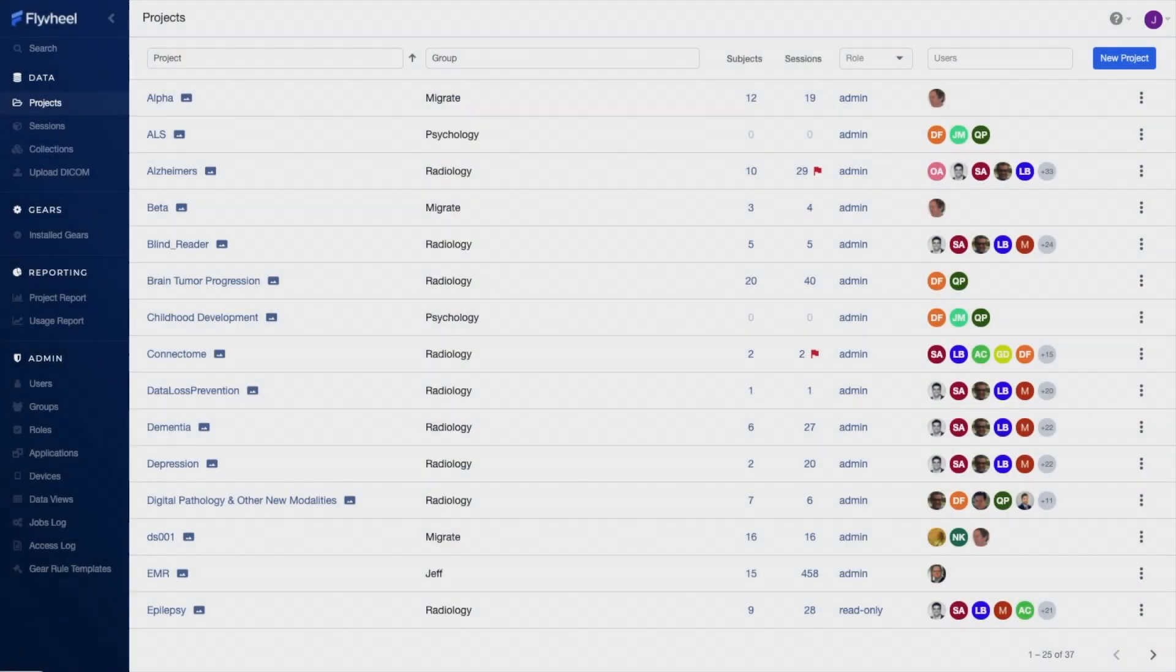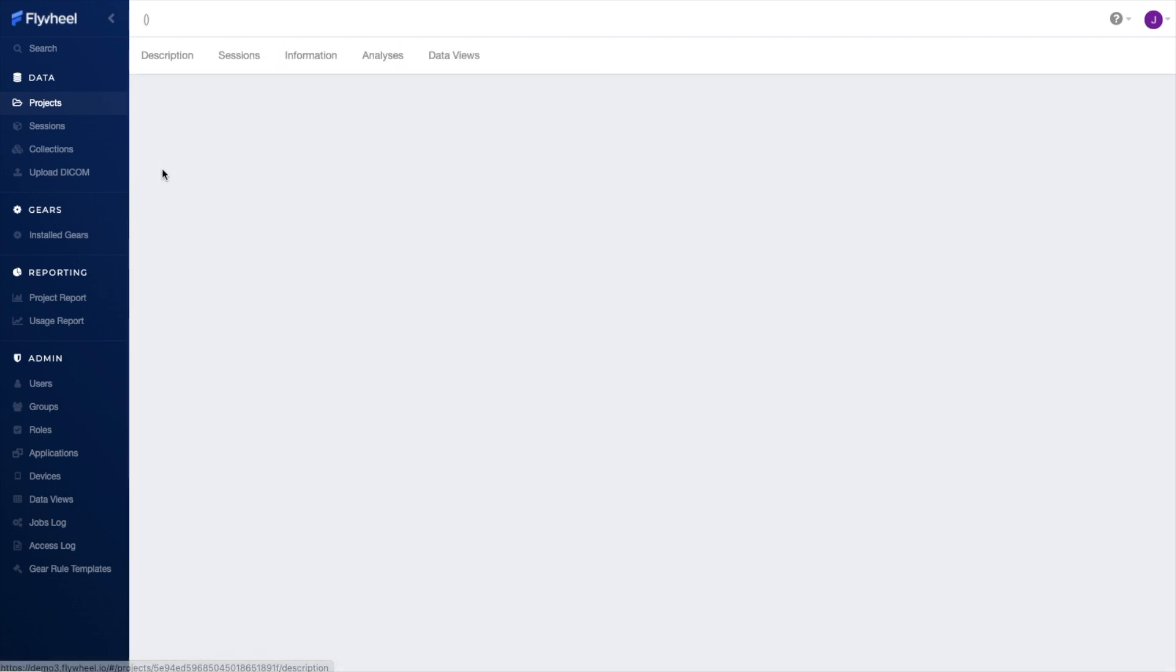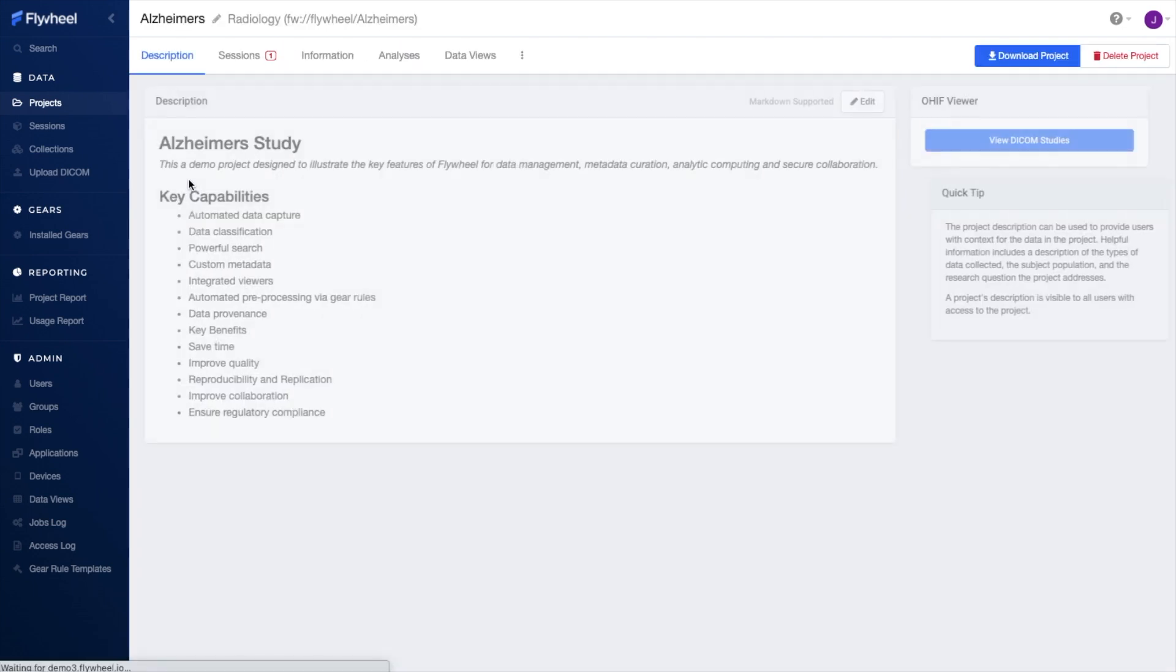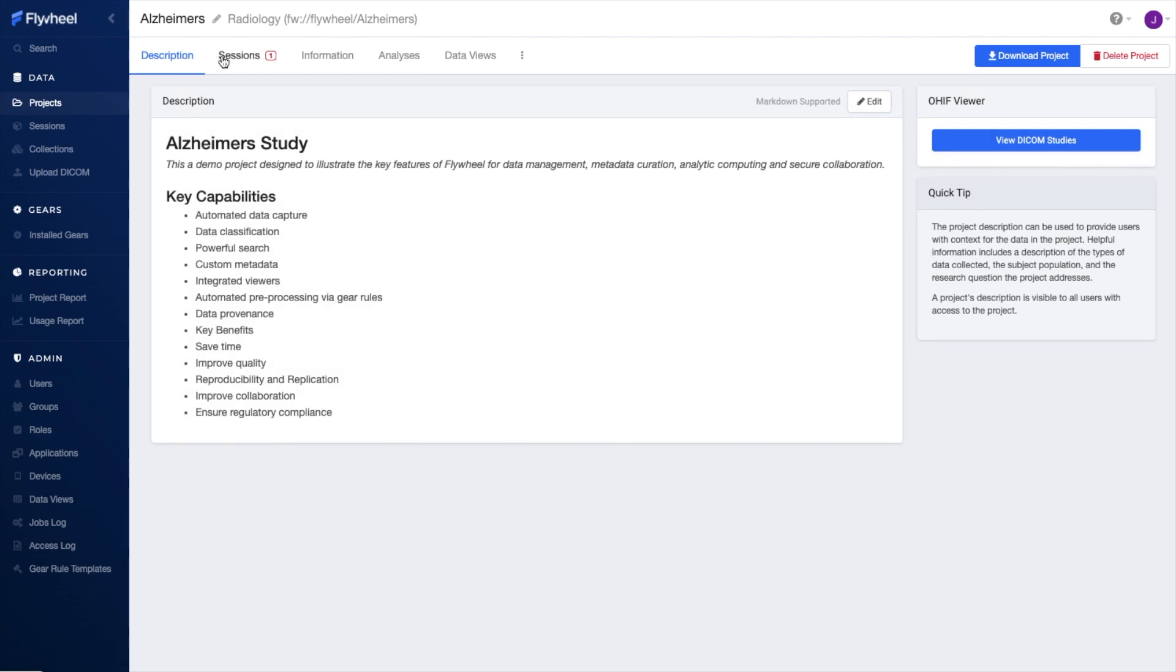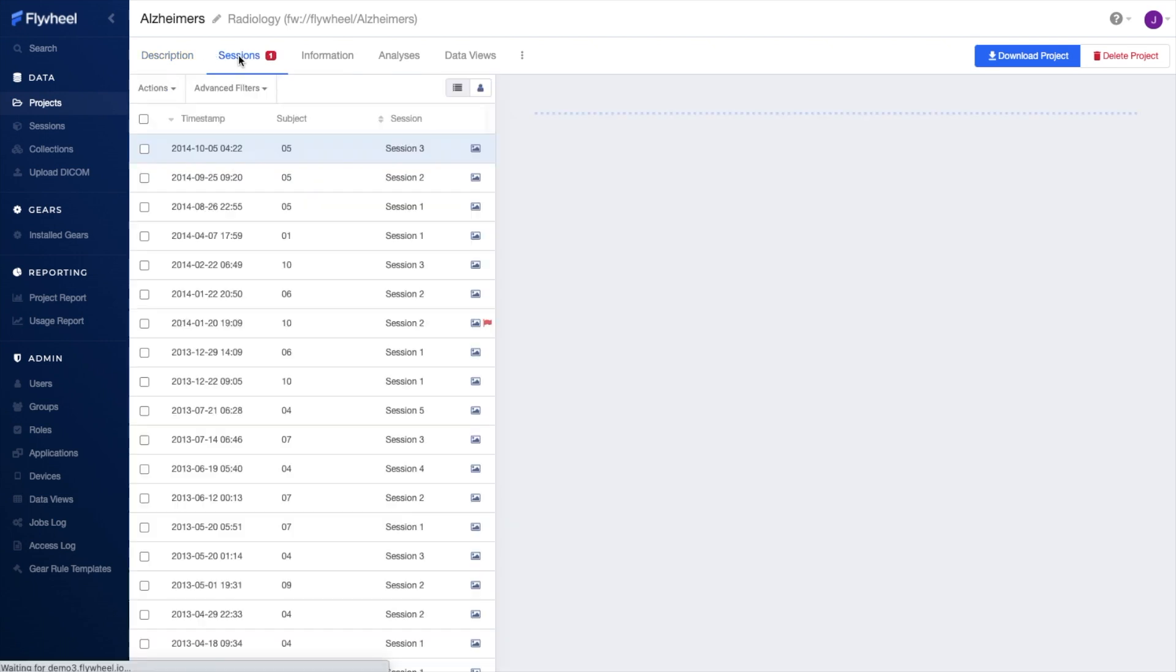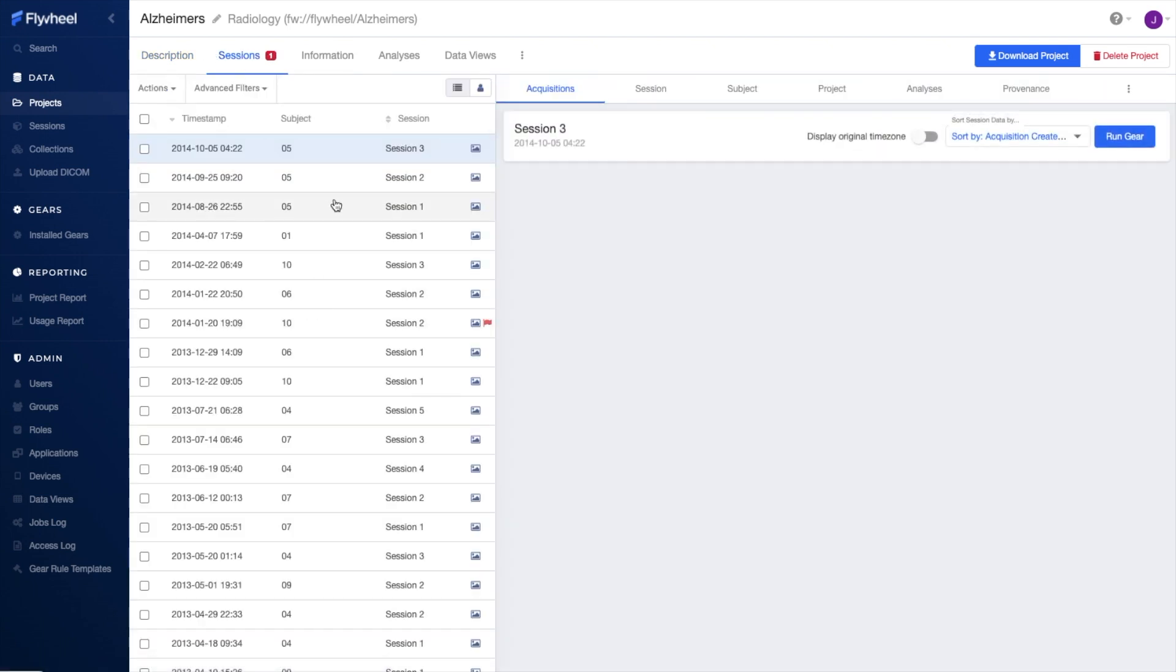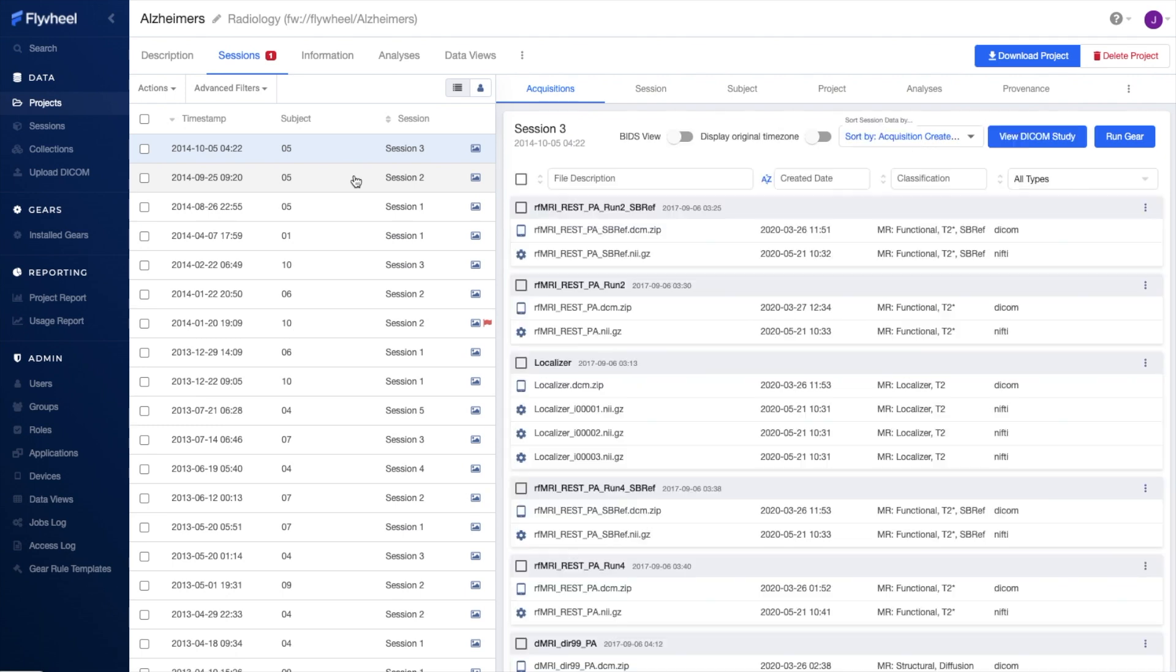Flywheel organizes your data in a convenient, easy-to-navigate research project structure. Role-based access controls ensure that your data is securely archived and regulatory compliant. Here in my project, we have a list of our subjects and their exams, or what we call sessions.